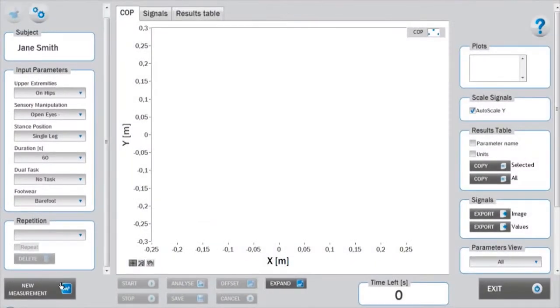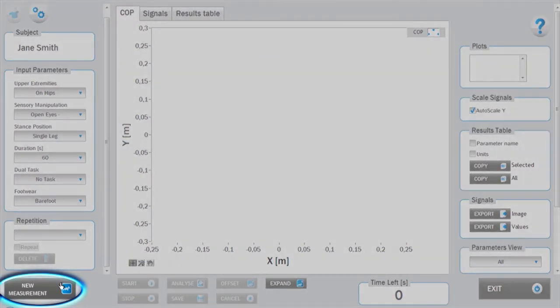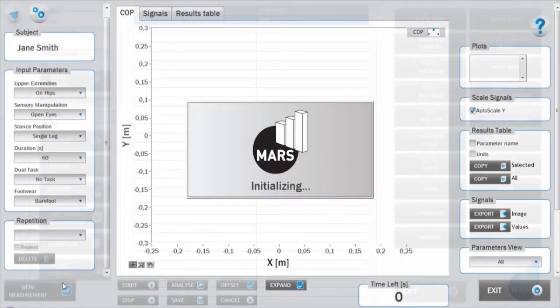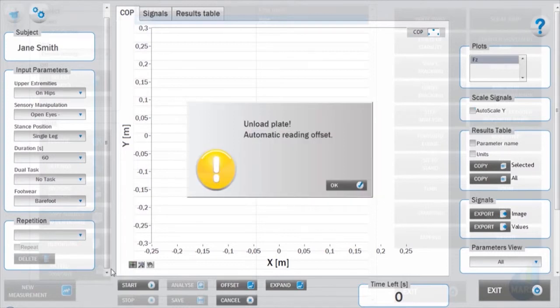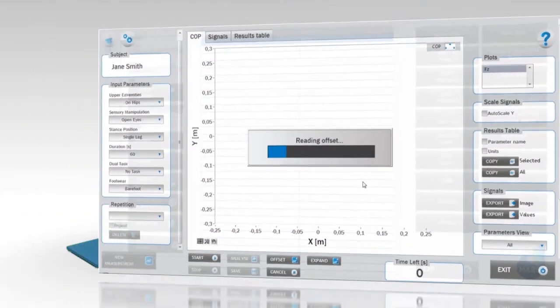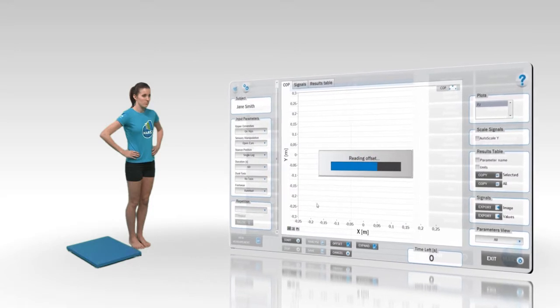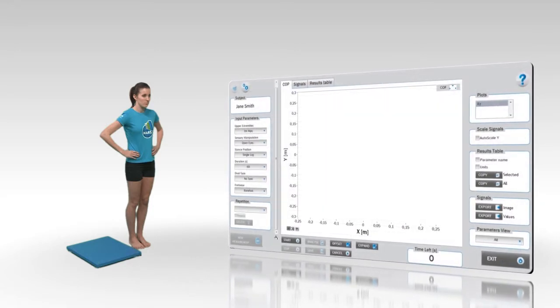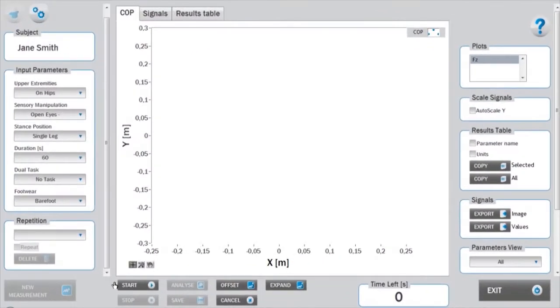To start with the measurement, click on the new measurement button. After launching the test module and clicking the new measurement button, initialization and offset takes place. During this time, the subject should not be on the force plate. If necessary, the test can be canceled by pressing the cancel button.